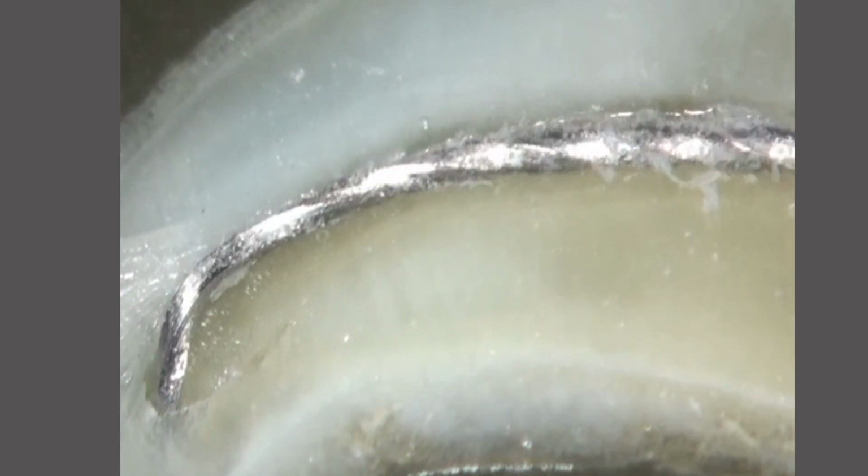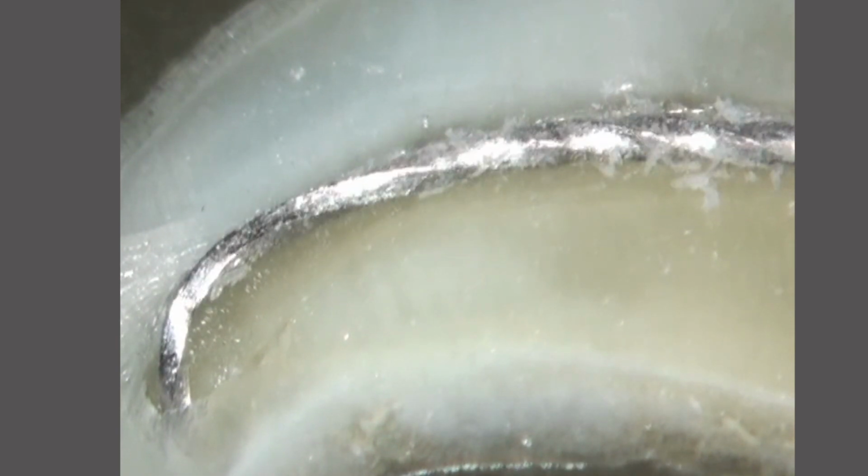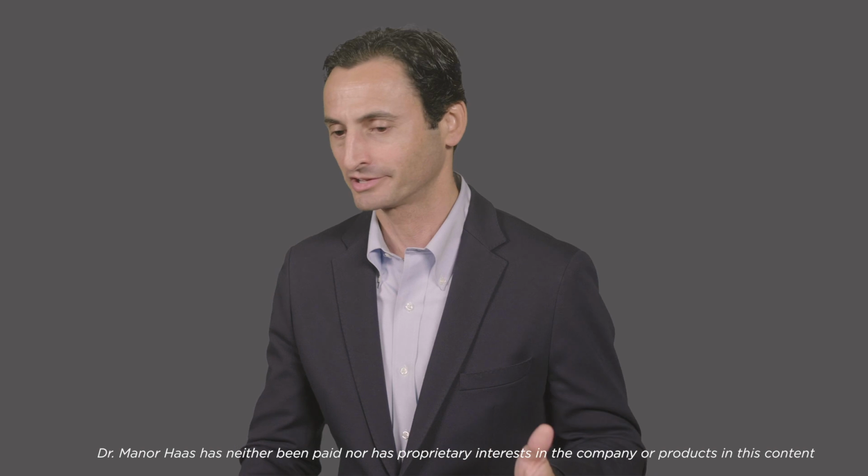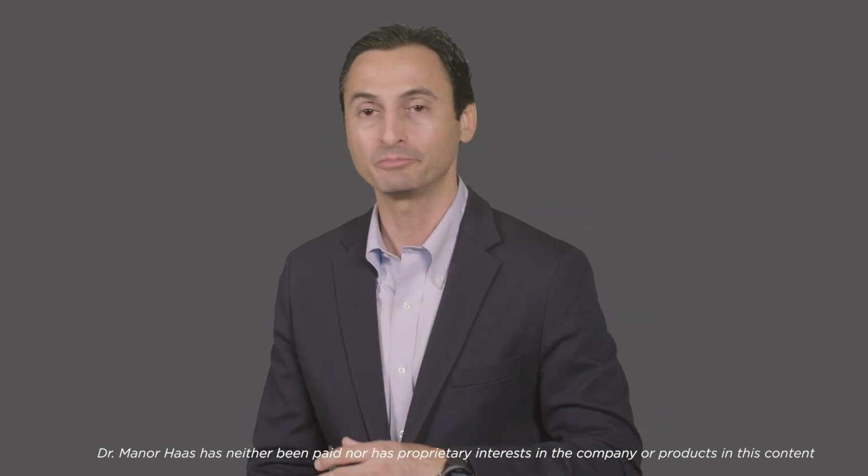So unwinding files, for me, is a huge issue. We should talk about it just as much as we talk about broken files, because the damage that they do to the apical part of the root is very, very significant. So the bottom line is, please try not to use nickel titanium mechanized files that unwind. Okay, try and do your best. I don't care how cheap or popular they may be, just try and avoid that, because that has a lot of consequences when it comes to obturation.